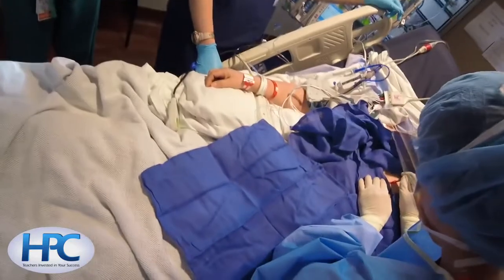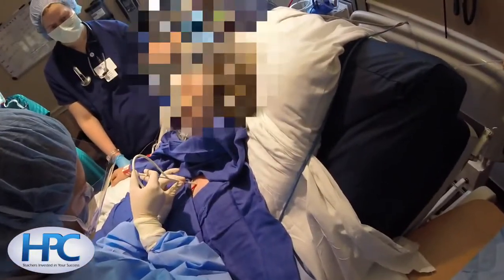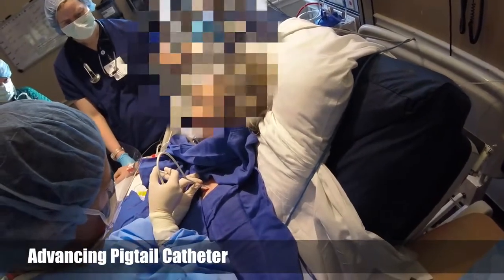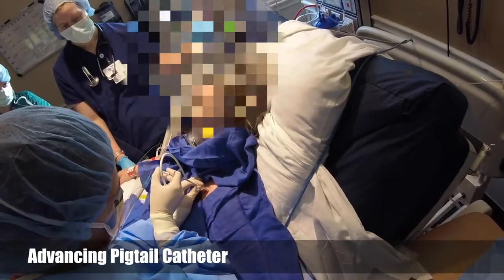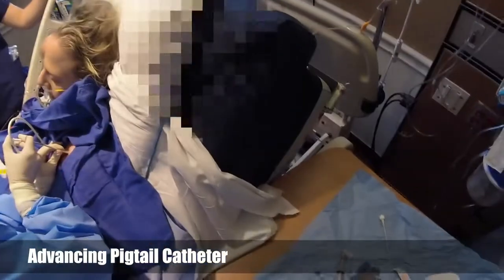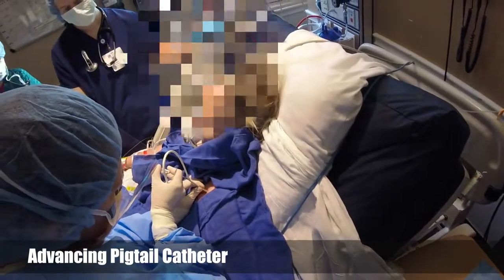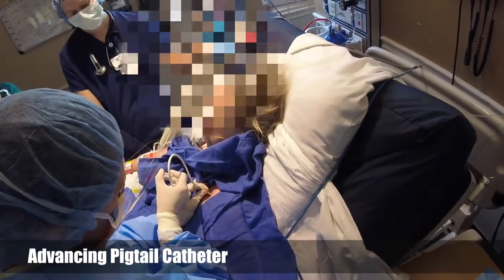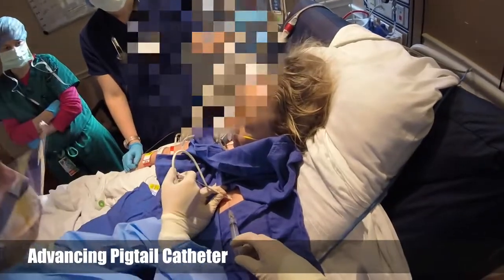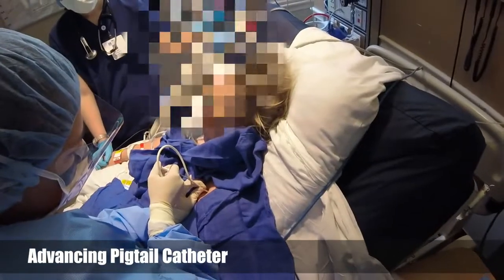We're going to use a scalpel to make a skin nick, and then with our thumb on the needle, we will advance the pigtail catheter perpendicular to the skin over the third rib in the midclavicular line until our fingers of our left hand are touching the skin, which will indicate the appropriate depth of insertion into the pleural space.